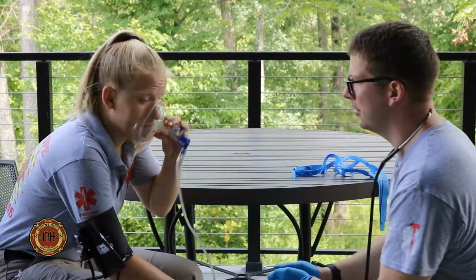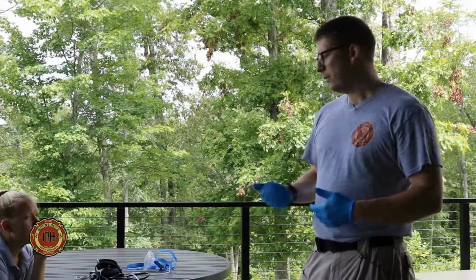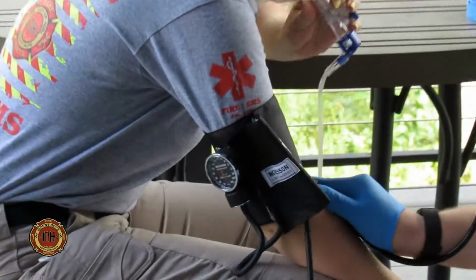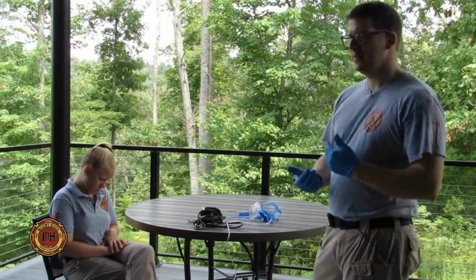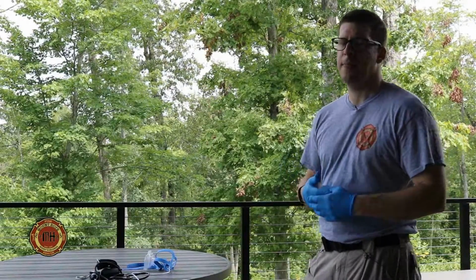After you've told the patient what you'd like to do, you'd like to double check your vitals and monitor your patient. You're going to have a pulse ox on your patient for the entire time that you're doing this procedure. You want to try to sit the patient up and have them help you hold the mask fast to their face. This is where you can see if the patient's going to accept this mask or if it's going to give them a little too much anxiety.